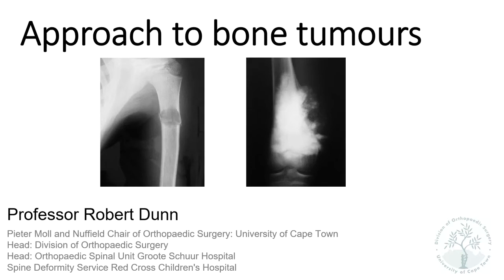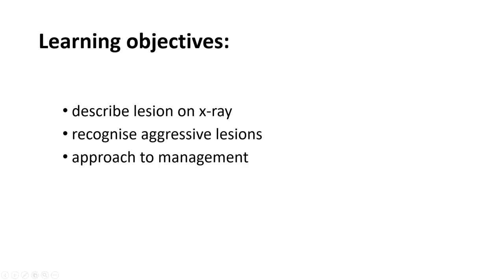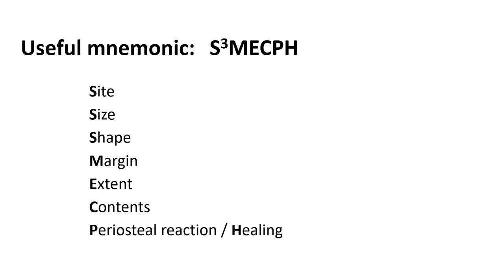We'll be discussing an approach to bone tumours. The learning objectives are for you to be able to describe a lesion on X-ray, to recognize the aggressive lesions, and have a general approach to the management of both benign and malignant tumours.